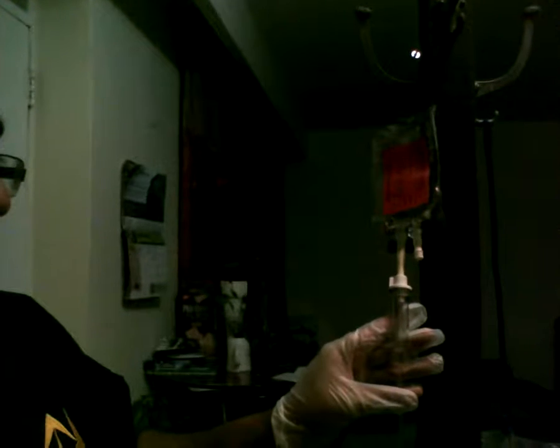Yeah, I just wanted to show you the flow rate because I don't have anyone to support me. I have to carry the whole video to you. I hope you can see from here. Let's just approximate as much as possible here. So I make sure it's 6 drops per 15 seconds.